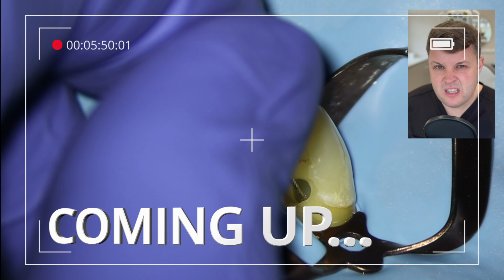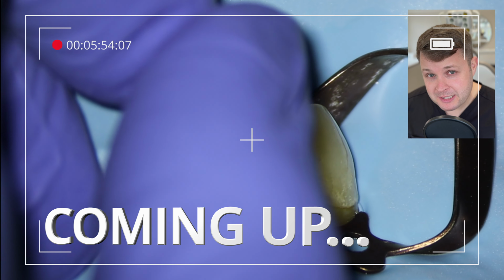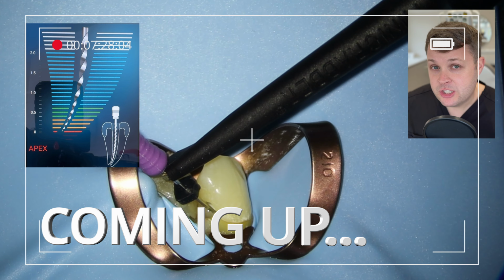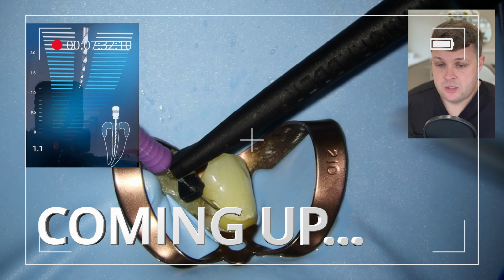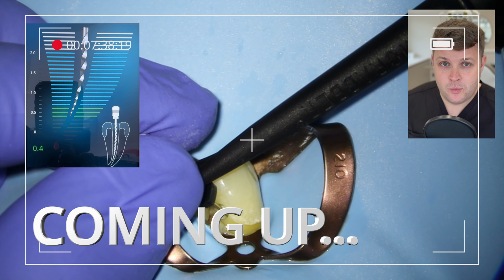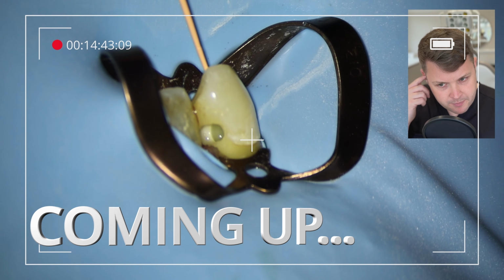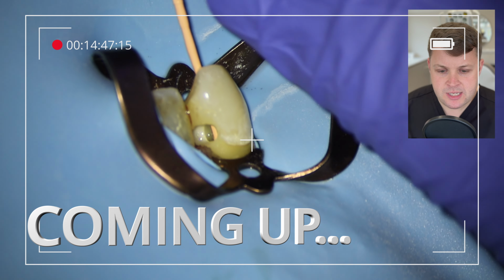I'm getting significant resistance from this file, and I'm thinking to myself, is this a bad idea? I feel like I've wedded myself to the idea of doing an access cavity here. And actually what I do realise is, because the access cavity is so close to the coronal aspect of the tooth and it's touching the gingival tissues, that the liquid from the access cavity is shorting out. You notice that sometimes it doesn't actually reach the zero reading. You might ask yourself why that is.